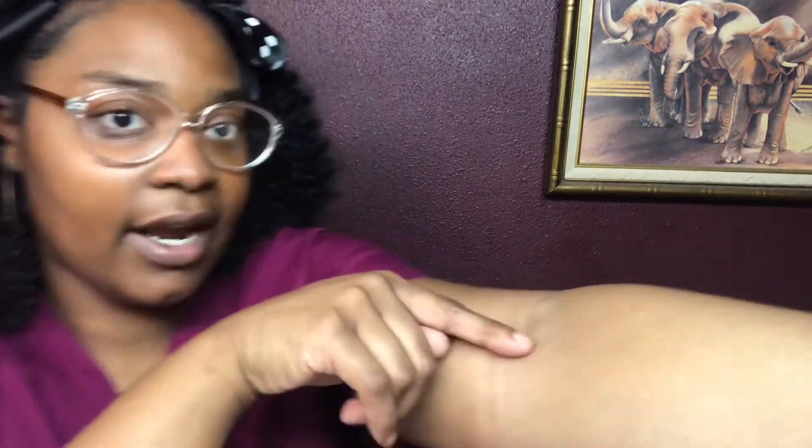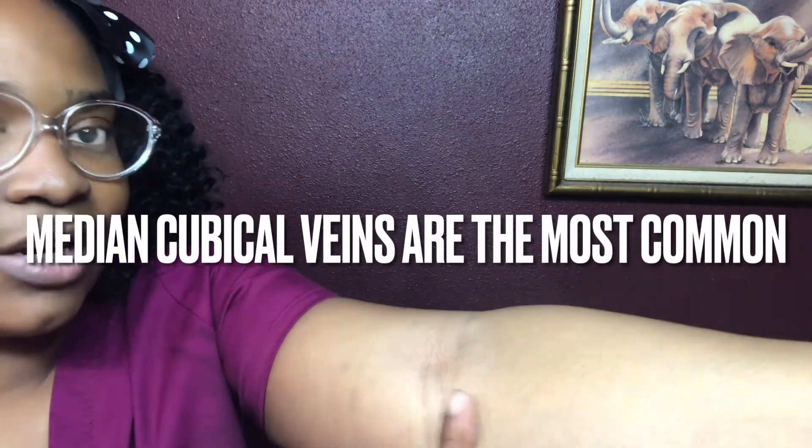The next step is to check for the veins — a term we call 'palpate.' Palpate means you're feeling for that vein, trying to get it pumped up so you can see it. Tell the patient to make a fist and you'll be able to see that vein pop out. You want to look for veins in the main area of the antecubital — the inside of the elbow. Don't assume that just because you see a vein pop out, it's the one you want. A person can have good veins but that doesn't mean they'll have good blood flow.